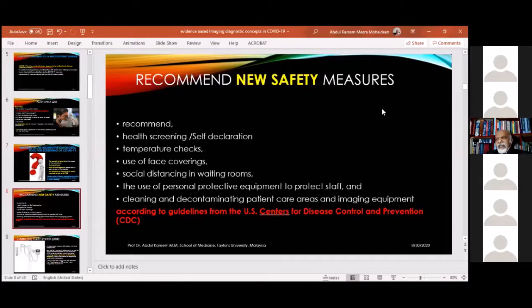Beside all these things, I have to emphasize the importance of decontamination of the equipment. That is very much essential in radiology department, because when the patient is tabled, he will be handling the tabletop, and he will be handling the cassette, he will be handling many parts in the many areas in the region. So the entire room has to be decontaminated.